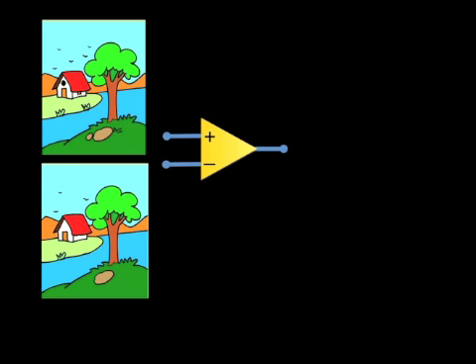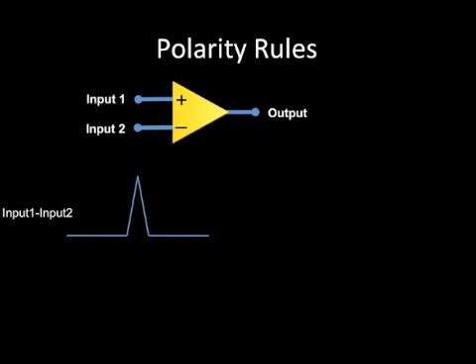In this case, we input the two pictures through a differential amplifier. And if we look at the difference between these two pictures as an EEGer might, we see that the difference might look something like this. This metaphor is an important reminder that we are never dealing with absolutes with EEG, but only differences. Because we are dealing with only differences, by convention, any tracing on EEG is actually a relative tracing rather than an absolute, and represents the difference between two inputs.